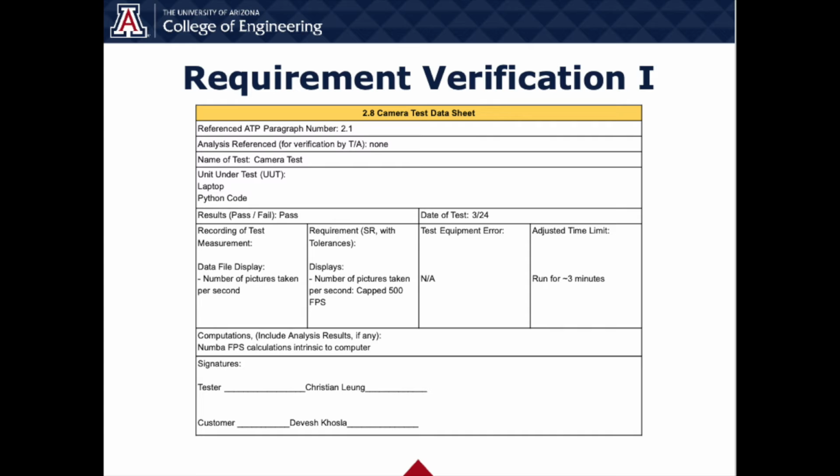The verification matrix is showing the image acquisition rate, which is the amount of images that are coming into the system. In order to successfully run our camera system, we need at least 500 frames of data coming in order to create those frames and actually process the data. As you can see, our system is capped at 500, but did meet the requirements needed.